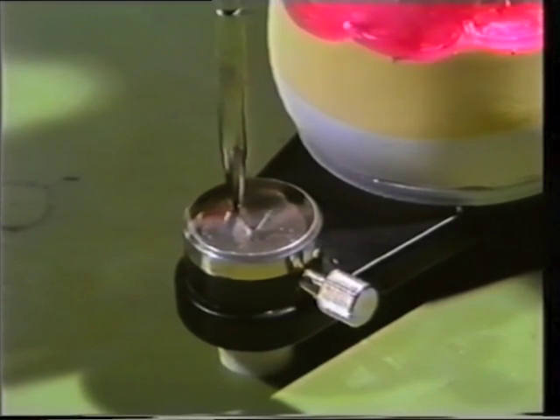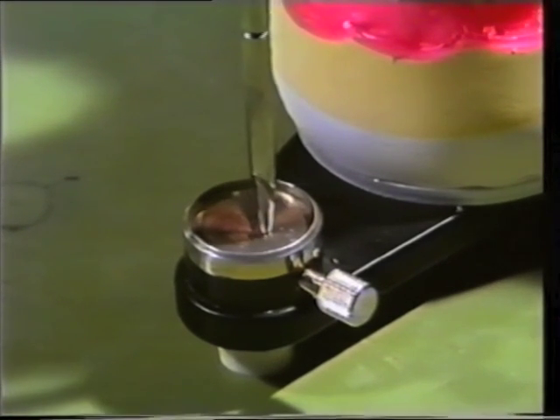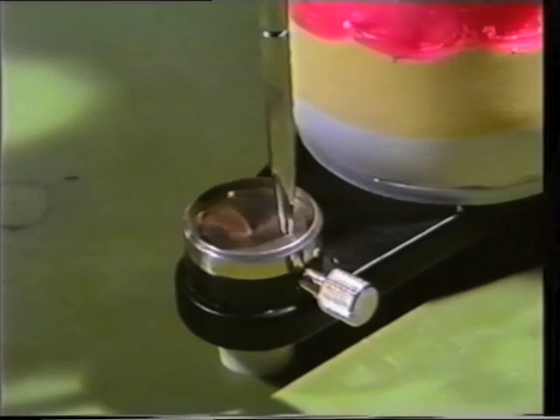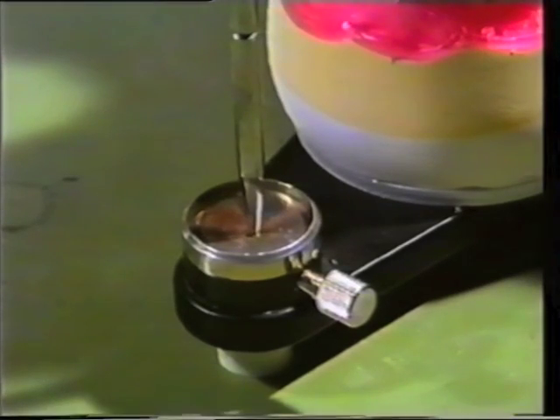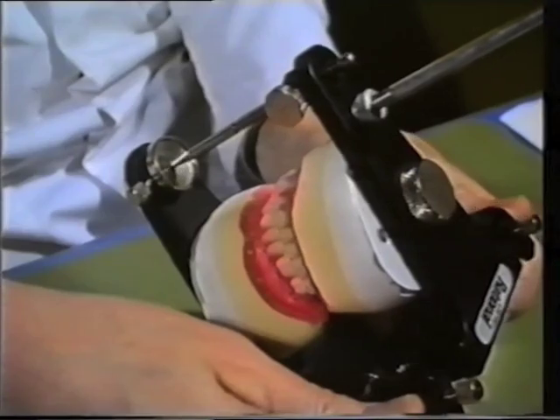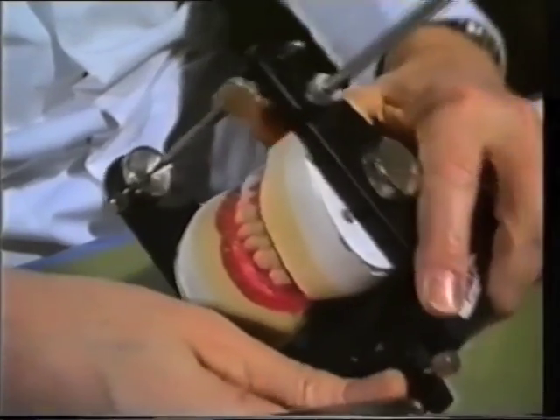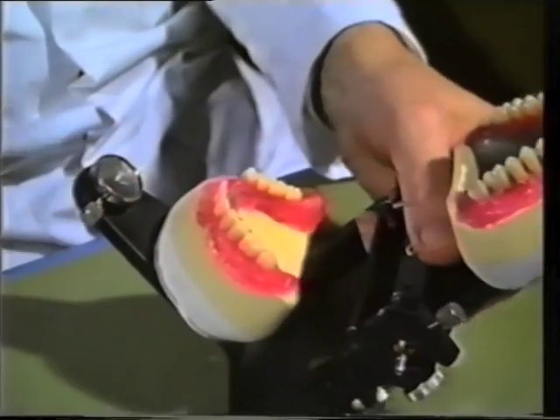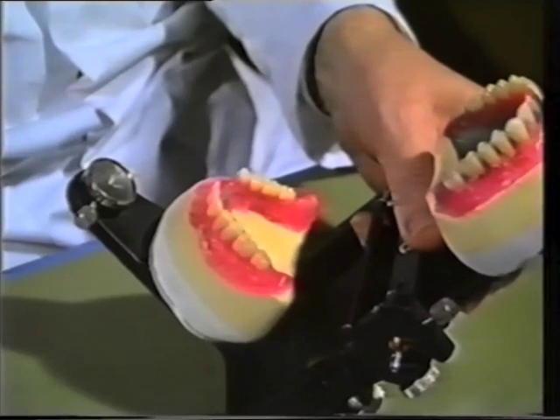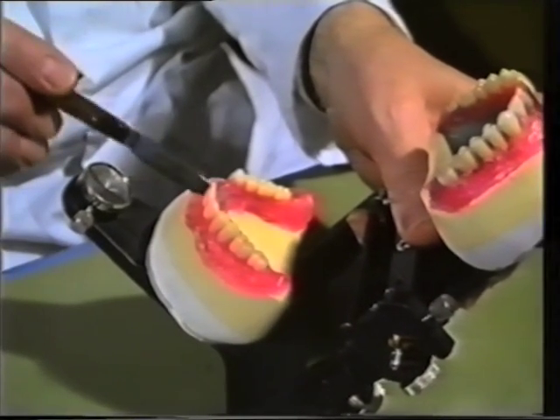Constant contact must be maintained with the post and incisal guidance table during the execution of these movements. With both sides of the mandibular posterior teeth cited in occlusal balance, the final phase of setting up involves positioning of the anterior mandibular teeth.